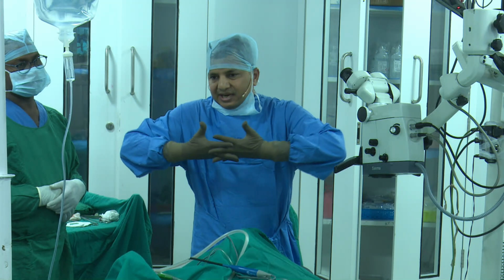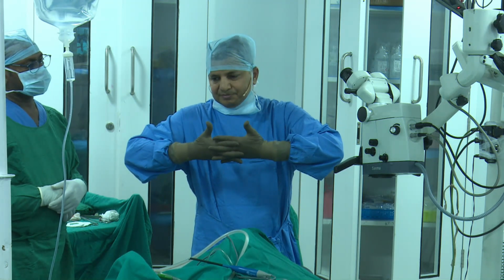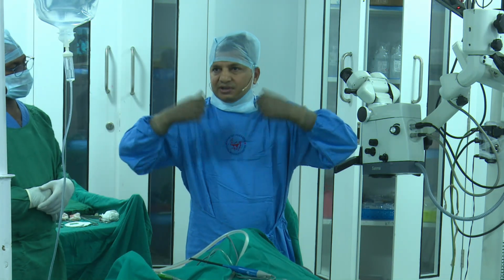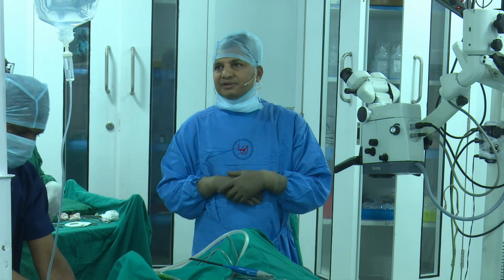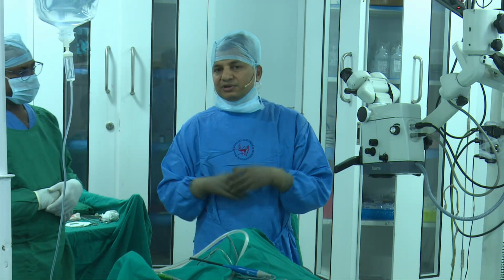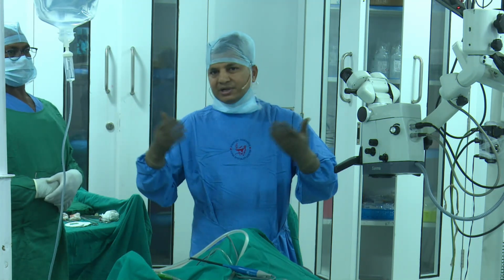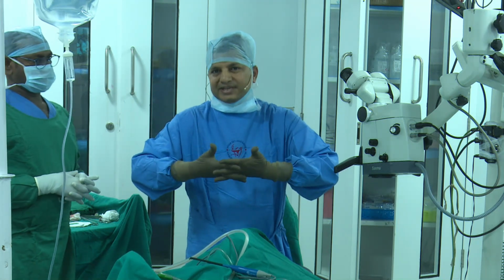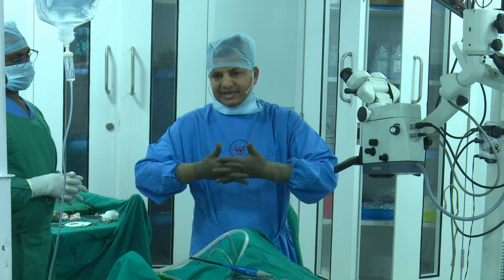The moment I started using this posterior barbed suture, while healing, the palate is kept anterior, so it cannot go posterior. It heals in the anterior position. That gives us a very good result. So directional healing is one of the reasons that I have used barbed suture. I initially used absorbable barbed, so that also did the work because the healing would happen in 6 to 8 weeks, or maybe 3 months. That time the suture would stay.